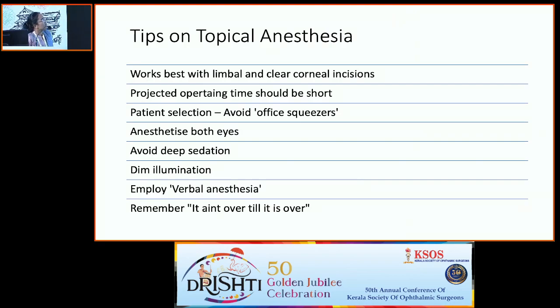A few tips when we are performing surgery under topical. The incision is best kept clear corneal, limbal at the most. The projected operating time should be short. And we should avoid office squeezers, that is, those patients who are uncooperative when we do a tonometry or indirect ophthalmoscopy. And make sure you anesthetize both the eyes.